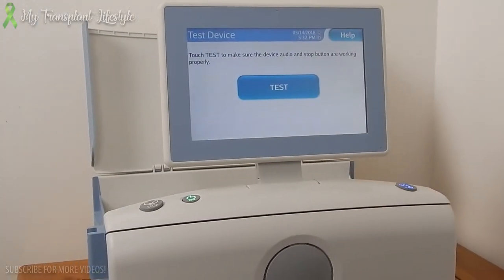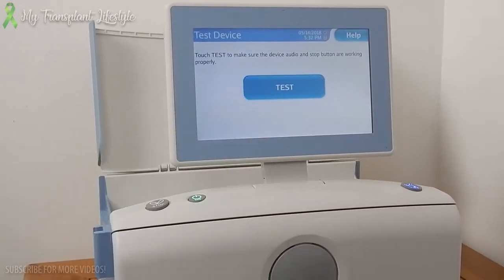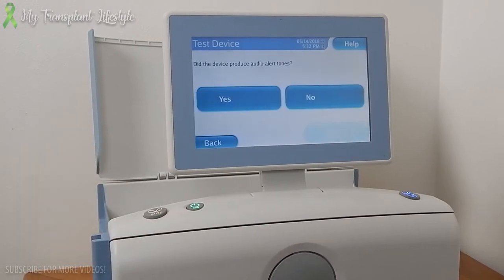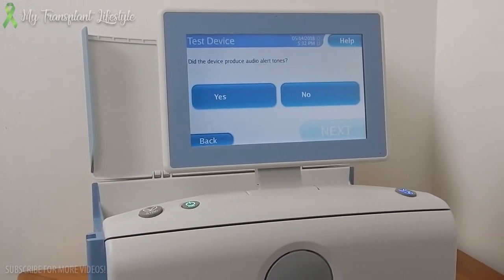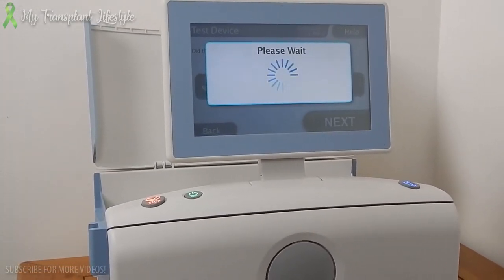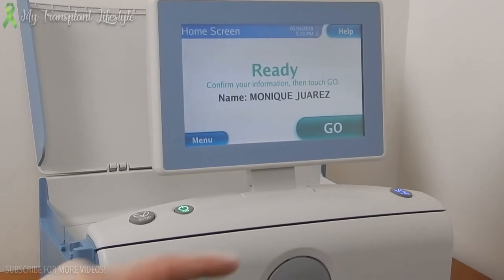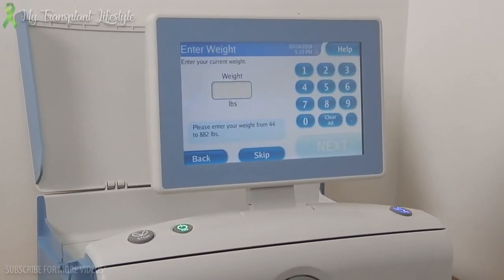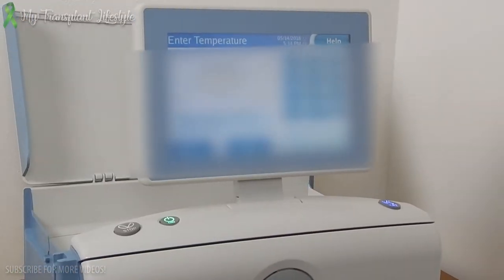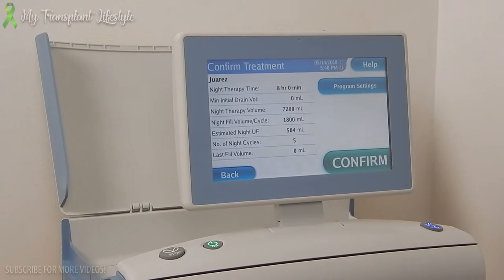Before starting your treatment, you are always going to make sure and test that your machine is still working correctly. Did the device produce audio alert tones? Verify your name, and when ready, press go. Before starting your treatment, enter your weight, blood pressure, and temperature. Make sure your treatment is correct. If so, press confirm.